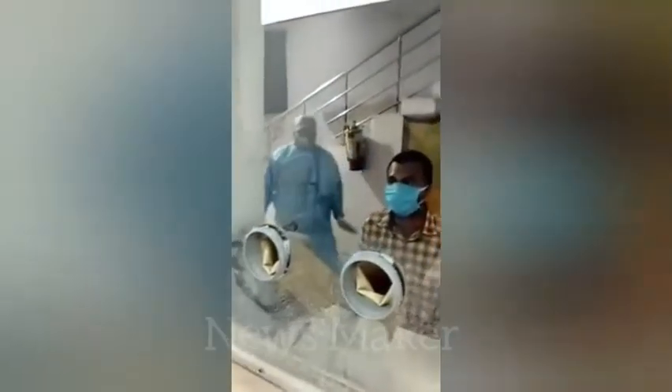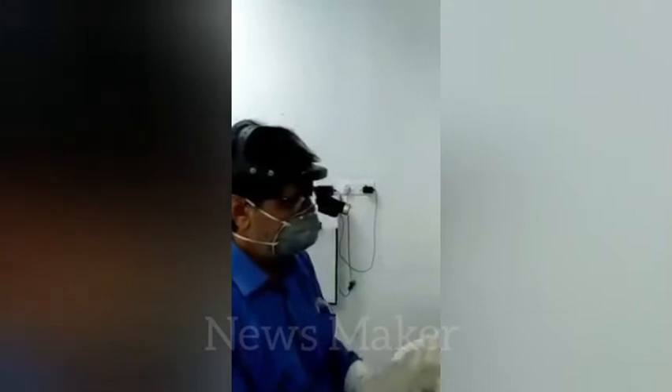The patient is also ready; it has been sprayed another time. The doctor is inserting the hands through the glass plate, and he has taken the swab — removing it, just taking it out. That is the swab with which the sample is taken from the throat.